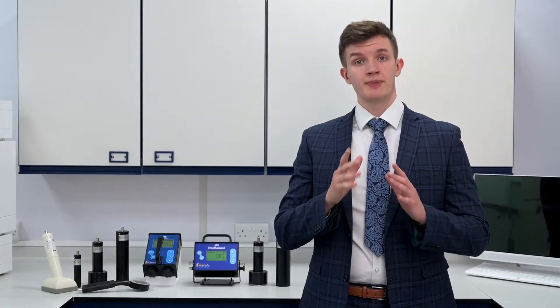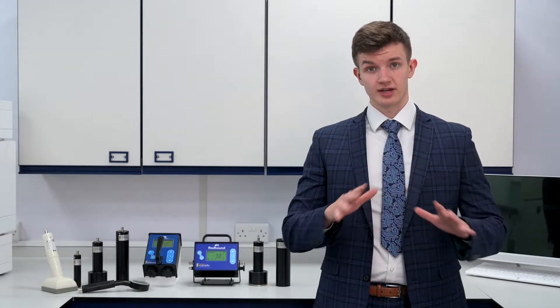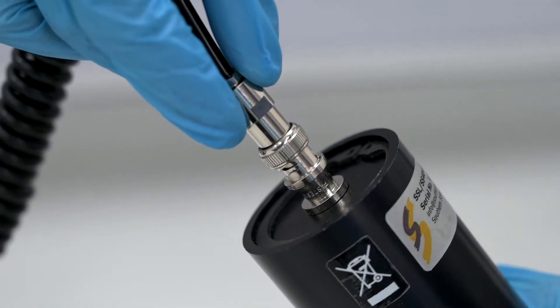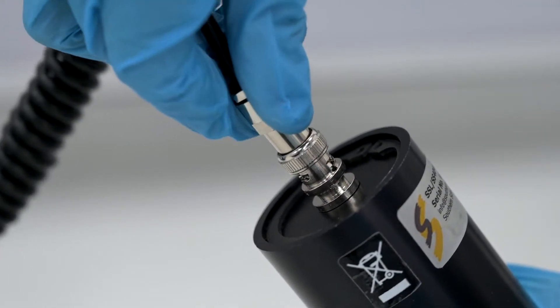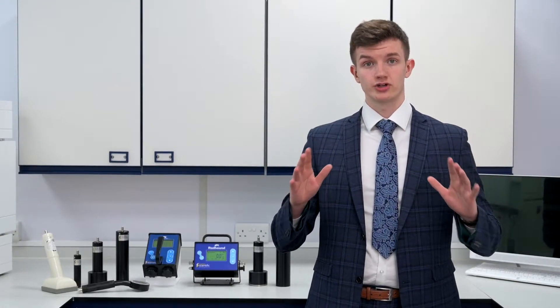Similarly, depending on your desired application, it can be tailored for your needs. Whether that's to detect contamination or to be used as a survey meter, the Radhound can be configured to detect alpha, beta, or gamma radiation. To make sure it's ideal for what you need, each Radhound is individually set up with one probe for your desired use.